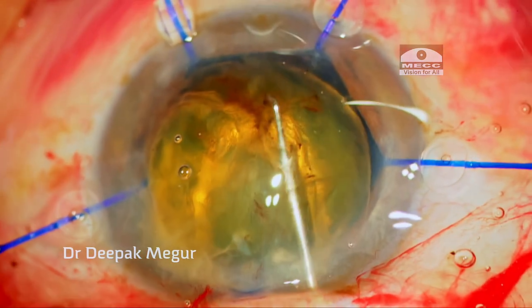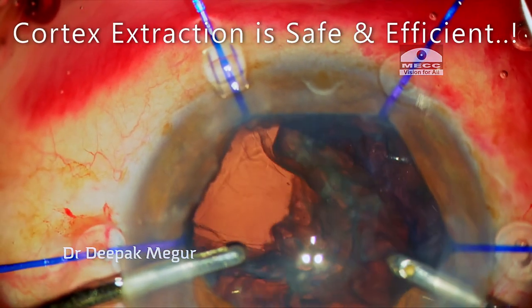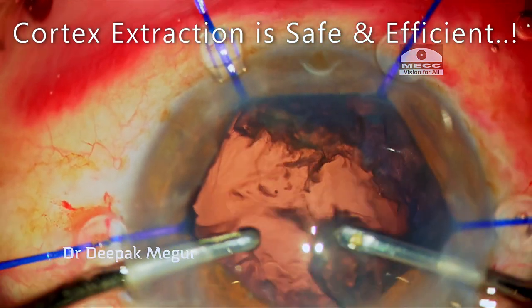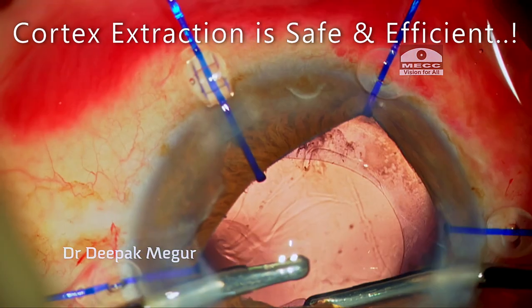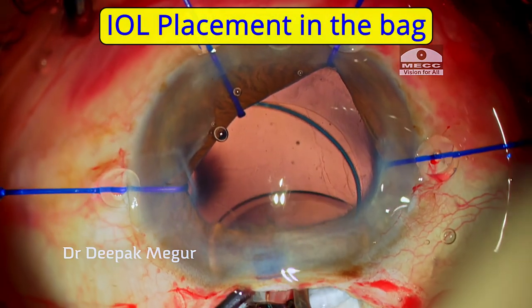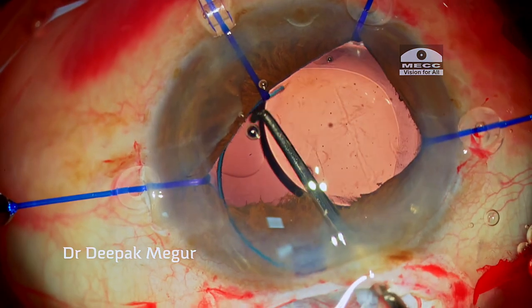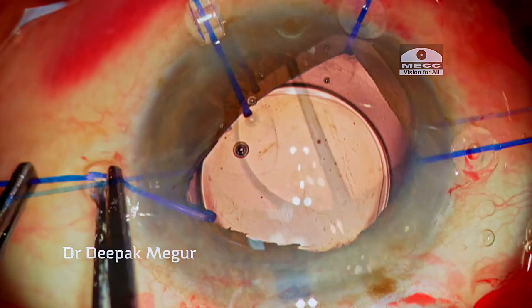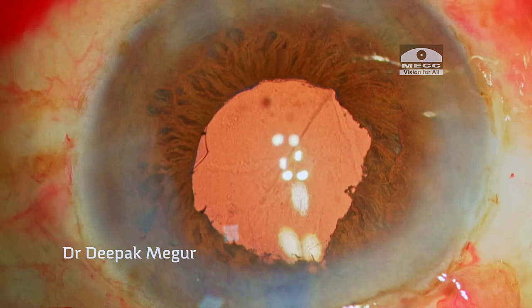At this point we need to realize one important thing: the most fundamental principle of surgery is to see well. Now since the pupil is well dilated because of the hooks, the surgery has become so simple. I can see where the cortex is; I am sure I am not catching the posterior capsule instead of the cortex. The surgery has become much safer and predictable. I could place the right lens in the bag, so in spite of the rhexis running away, we could achieve the best possible outcome without any compromise.